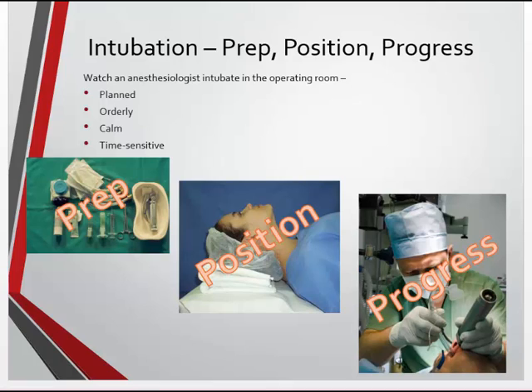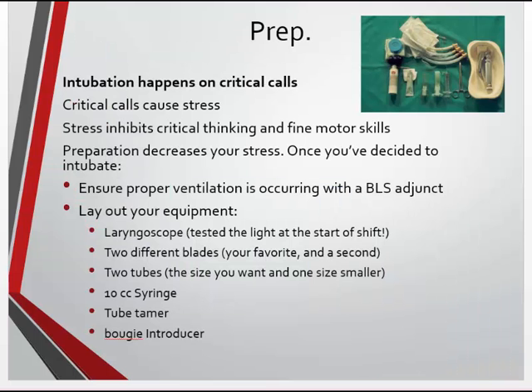If you watch people in the OR intubating, doctors who do this for a living, anesthesiologists, they do this in a planned and orderly fashion. They are relaxed, but they're also doing it in a quick fashion because it is time sensitive. Once you've paralyzed a patient in an OR setting, that patient needs an airway immediately. So we have prepping, positioning, and progression.